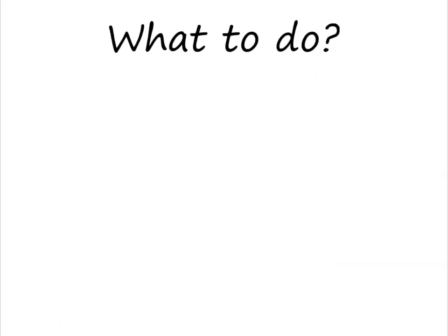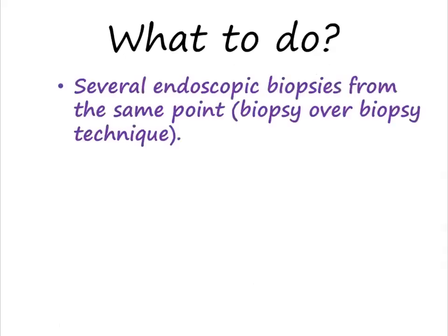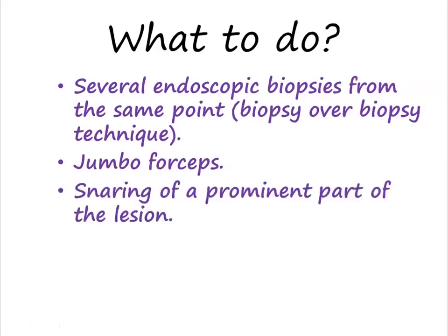Then what to do for histopathological diagnosis? Some recommend several endoscopic biopsies from the same point. That is what is known as the biopsy over biopsy technique. Some recommend doing jumbo biopsy by jumbo forceps. I didn't use it before. Some recommend snaring of a prominent part of the lesion. This is very, very yielding and very effective, but sometimes carries a little risk of bleeding.